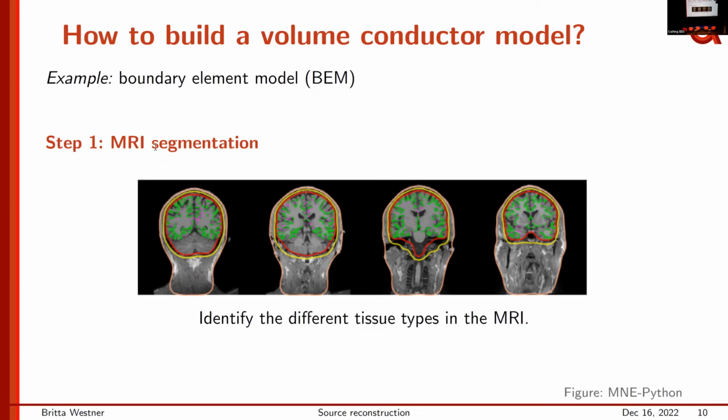I would probably recommend for things like max filtering, if you have a system that does that, you might try and switch the max filter off on your data for source reconstruction. And for sensor level, it might look nicer with that. And then you can just report that in the paper as such and reason why you did that.